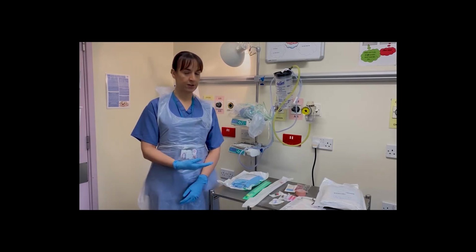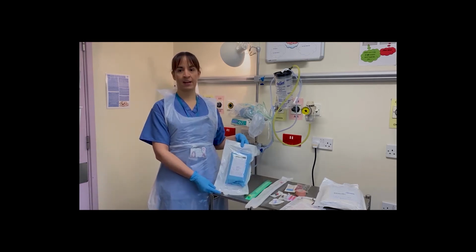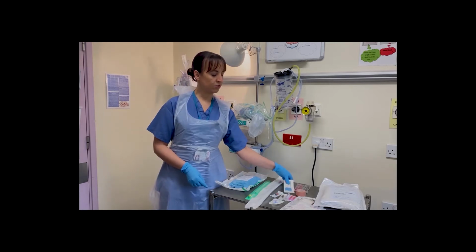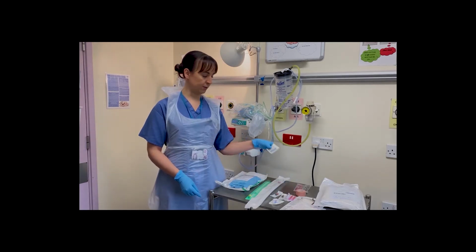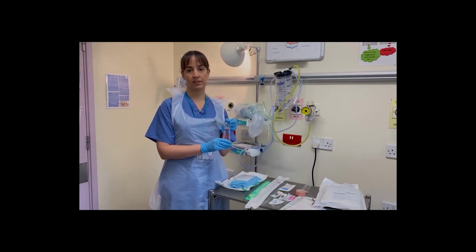To start with, I'll run through the equipment needed for this procedure. So first of all, you'll need a large metal procedure trolley, and then your umbilical catheter pack. This contains drapes, gauze, all the instruments you'll need such as forceps, scissors, dilator and a scalpel, gallipots, syringes and a tape measure. You also need some sutures for securing the lines afterwards, and your cleaning solution including chlorhexidine.